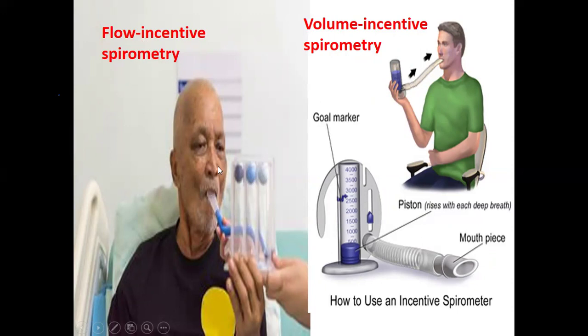The incentive is the benefit that the patient sees or gains from an activity. So the patient will be given instructions to breathe, and as they are breathing in, they can see the balls rise, and they are trying to make sure that the balls rise further or much higher. The patient follows the instructions as they are trying to reach this incentive.